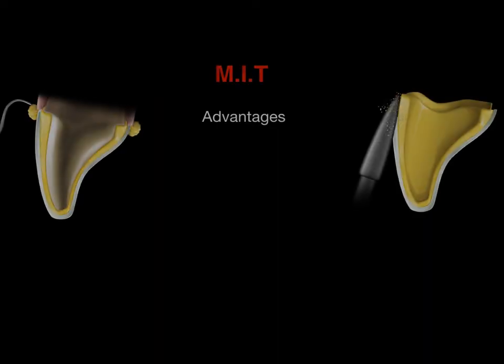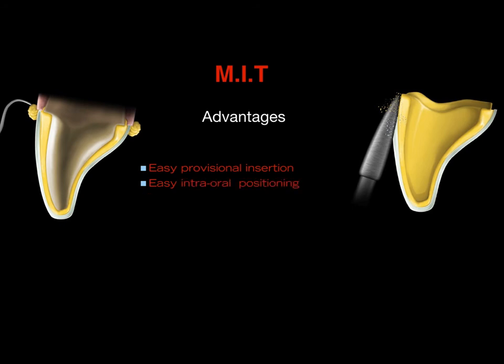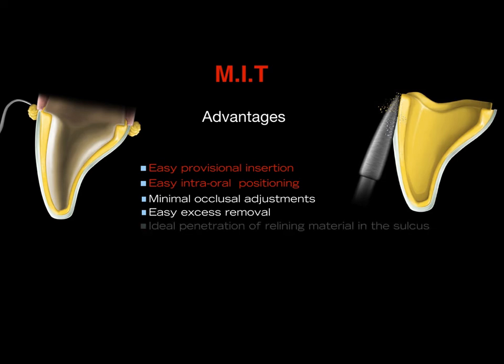So what are the main advantages of the MIT technique? First of all, the easy provisional insertion and the easy intraoral positioning. That's the most important step. In this way, you can really replicate what we have obtained in the wax-up. Then, minimal occlusal adjustment, because you are guided by the occlusion. Easy excess removal, because you don't push your finger against the margin, but you remove all the excess.